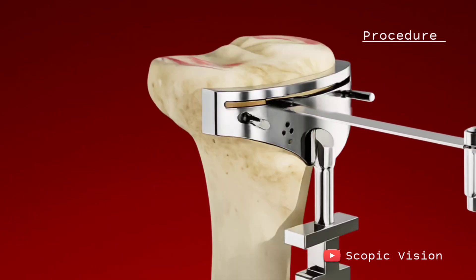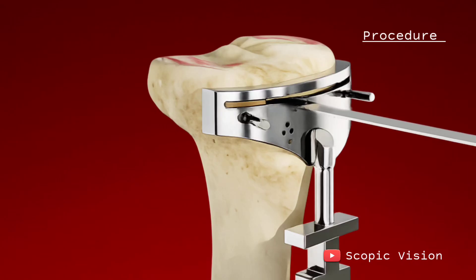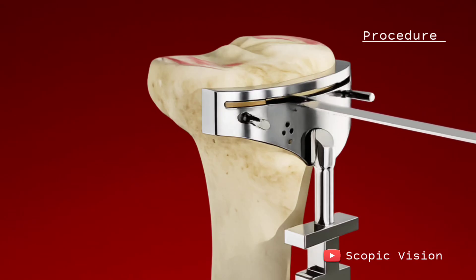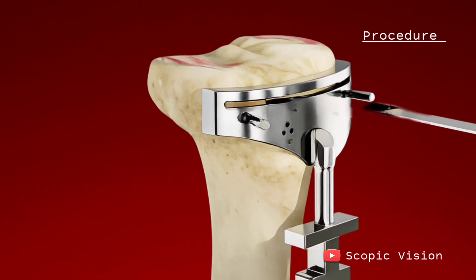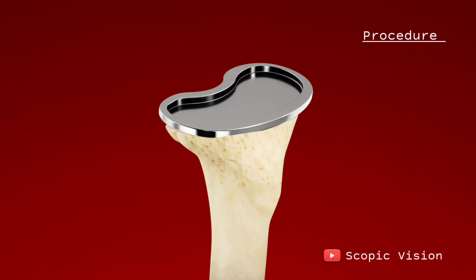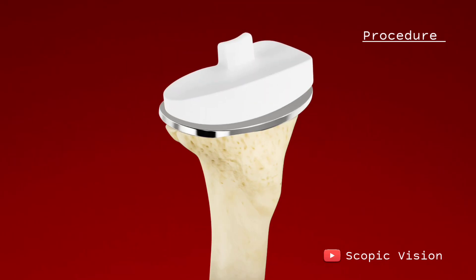Next, they turn to the shin bone. The surgeon removes the damaged bone and cartilage at the top of the tibia, shaving it down to a flat surface and clearing away any bony overgrowths. Then they attach the tibial component, which may also be secured with cement or screws.